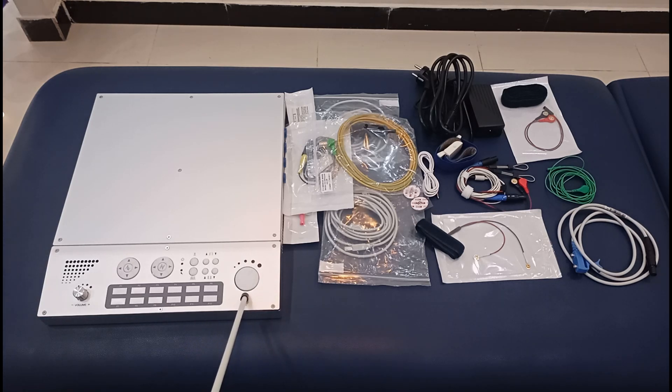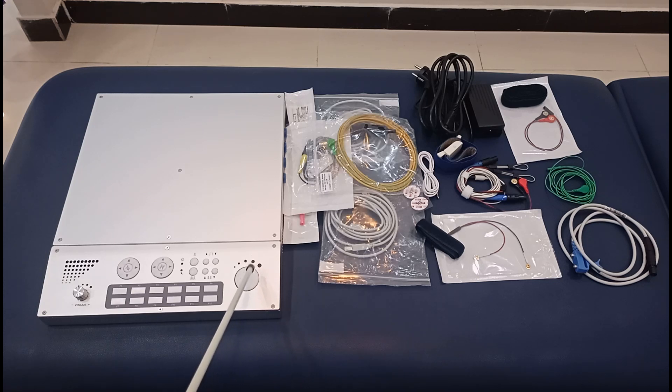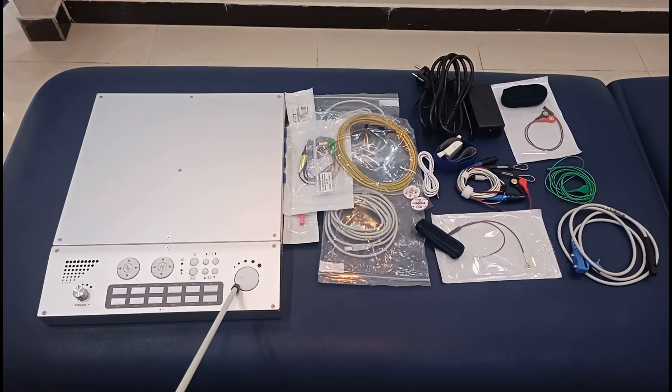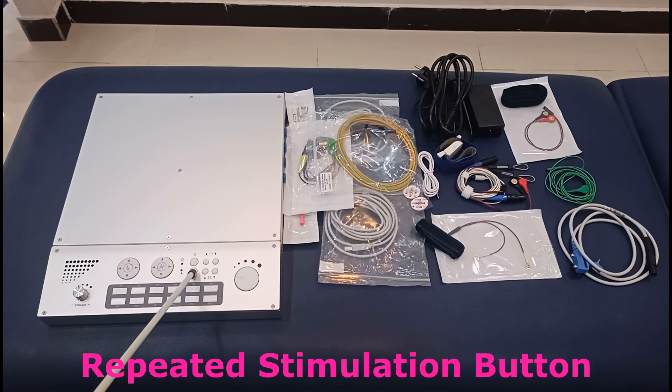This knob or dial can be rotated clockwise or counterclockwise. As you can see, the bigger circles represent an increase in intensity, so this is used to amplify or increase the amount of stimulating current. In the clockwise direction you increase the intensity, and in the counterclockwise direction you decrease it. This is the LED for the mains, and this LED also tells you if the unit is functioning.